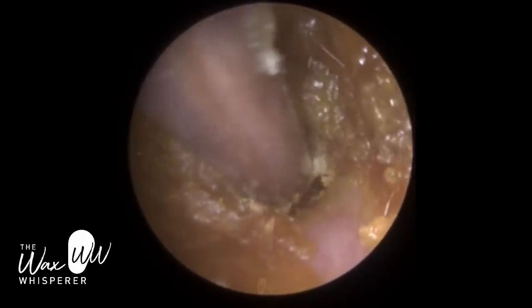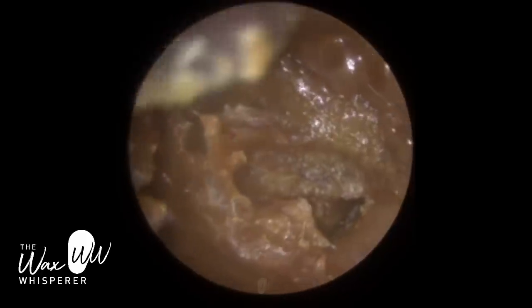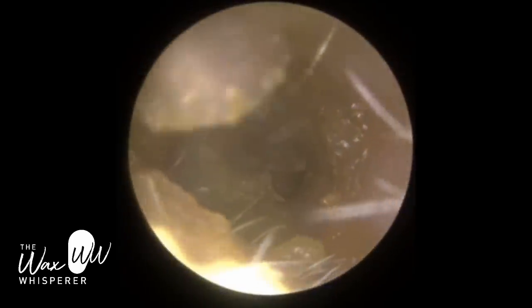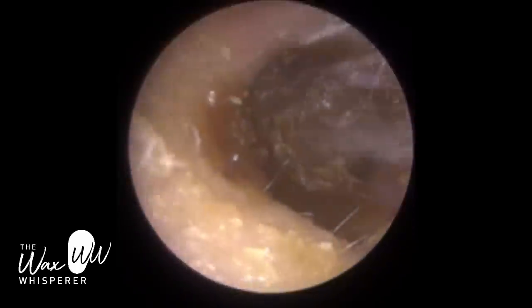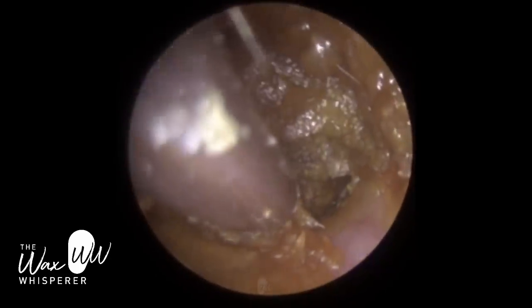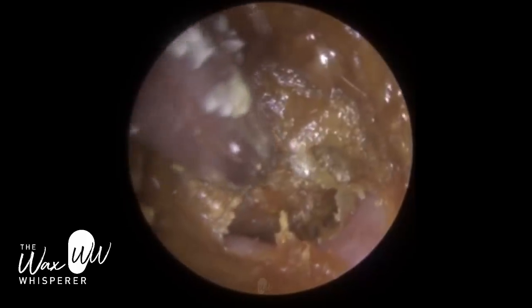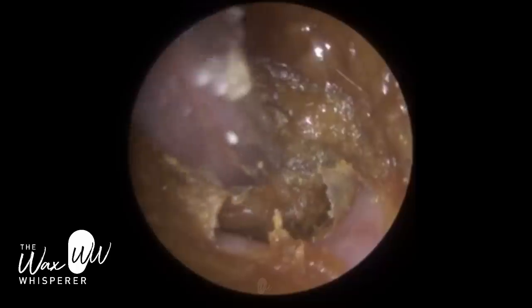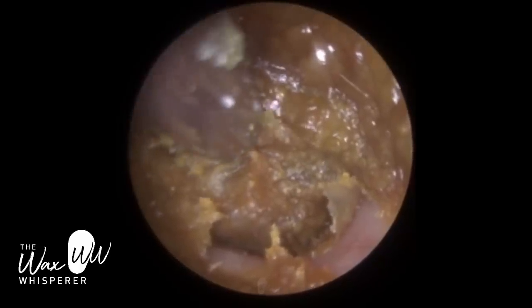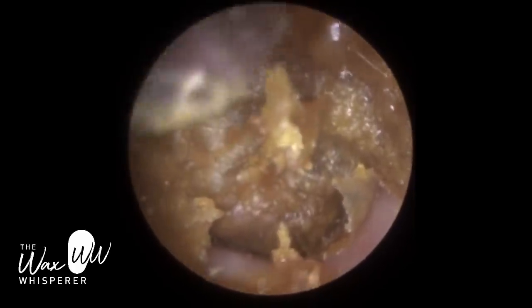One of the questions I often get asked is: why do I go for the middle part of the ear, the main body of the wax? Sometimes removing the wax on the edge of the ear canal will help facilitate removing the main bulk, so we often try to remove the wax off the canal wall. But in this case, I can tell that removing the surface wax won't really help remove the main bulk. As a clinical ear care practitioner, my main objective is to relieve the patient of their symptoms. Even if there's a bit of wax around the edge that's not going to impact hearing, I want to go for the problem area — that's the main bulk.